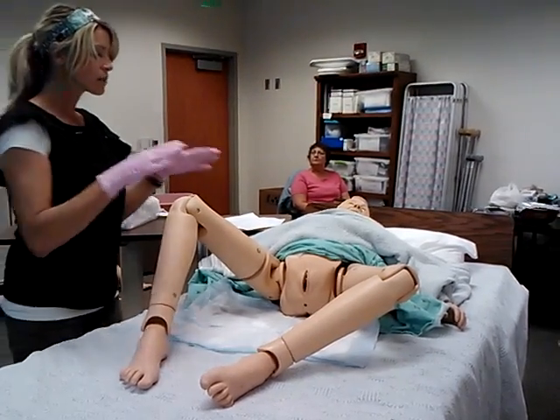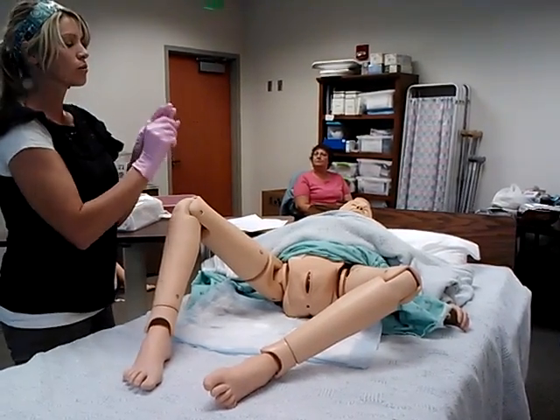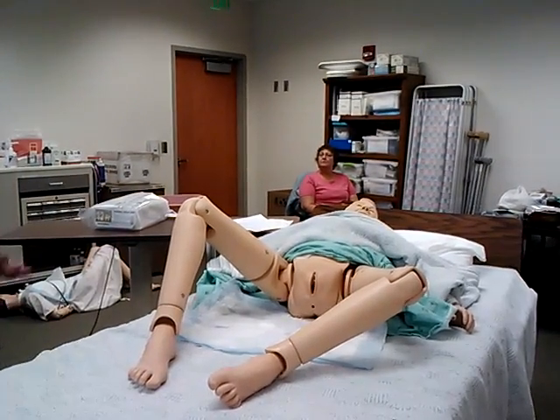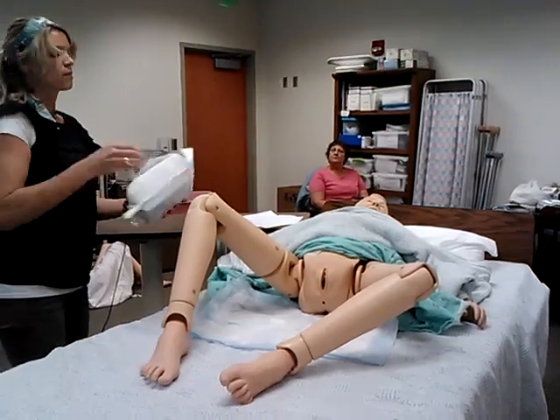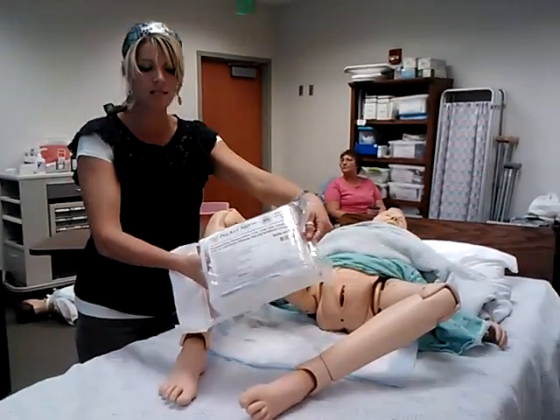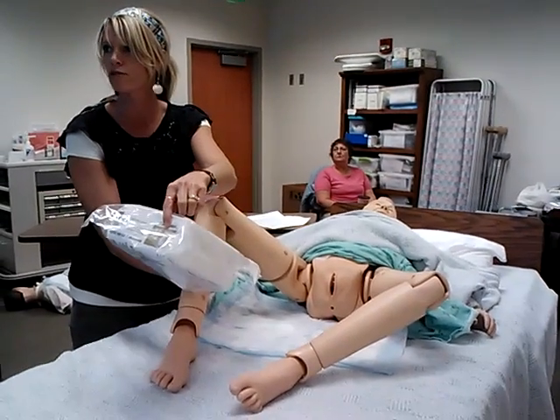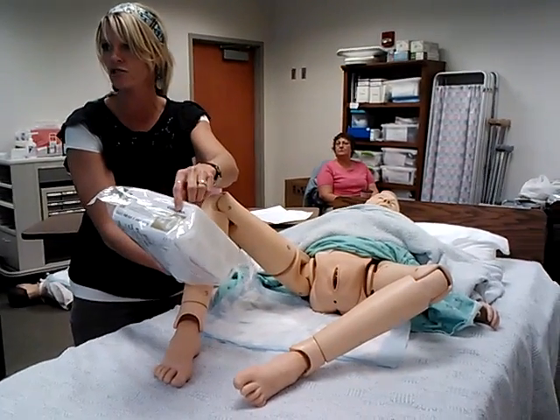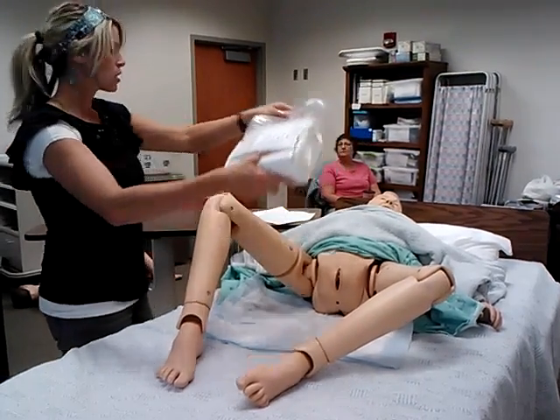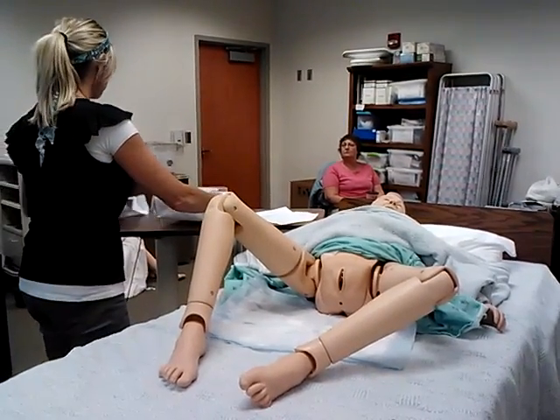So then after you get pericare done, then you're going to open up your box. So you open your box up. You guys can see your box. And it needs to be 12 or 14 French, which is normal for catheters. That's what normal is. All right, so you open up your box.